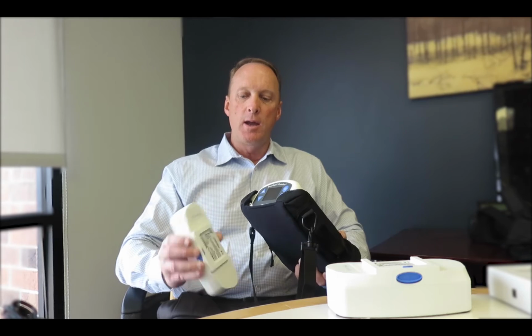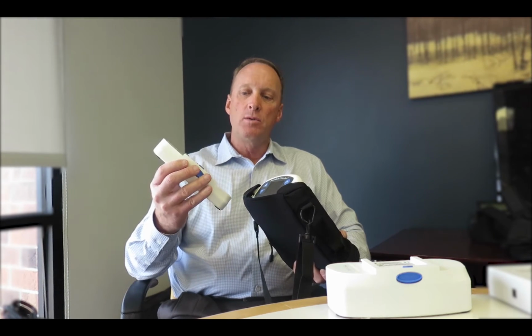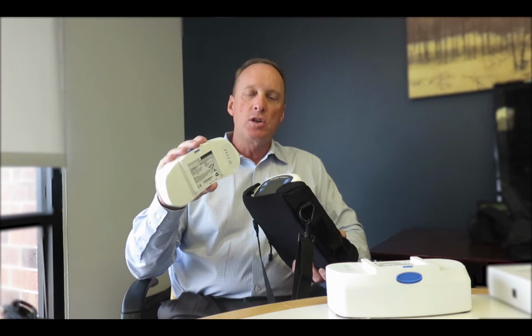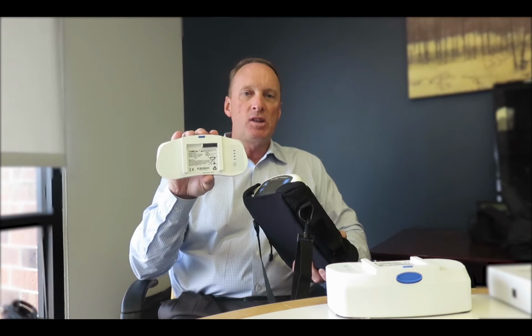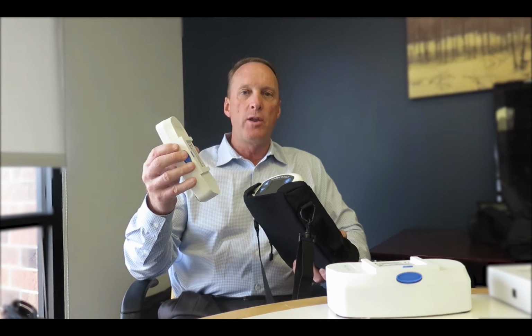a cycle. Okay, and similar to your cellular phones or your iPhones, the battery won't just stop working after 300 cycles. It will actually just start to slowly degrade like your cell phone batteries. So test mode will allow you to go in and see with the patient how many cycles they have on their batteries, which gives you a great reason to upsell them for new batteries and make sure, again, you understand what the battery performance is.